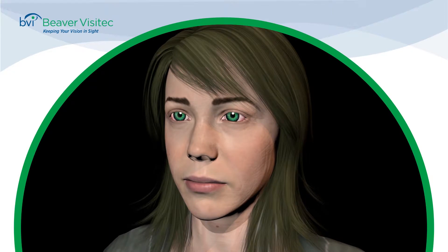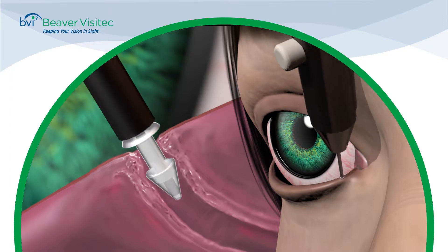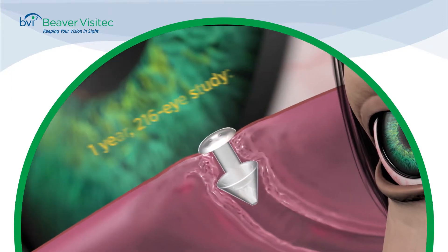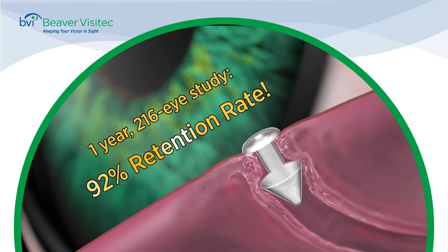The conical nose of the Parasol is designed to constrict during insertion and then expand to provide a custom fit. The Parasol's excellent retention is illustrated in a year-long study of 216 eyes that reveals a 92% retention rate, superior to any other plug on the market.